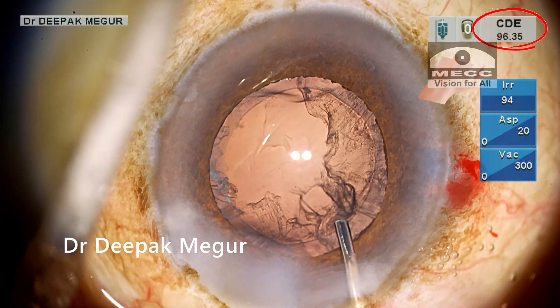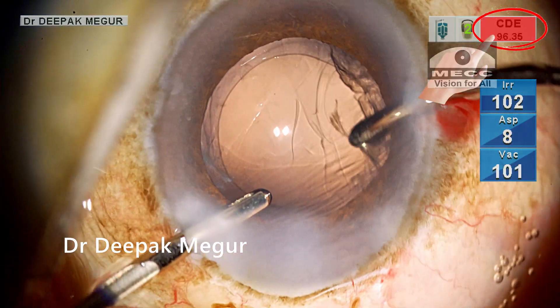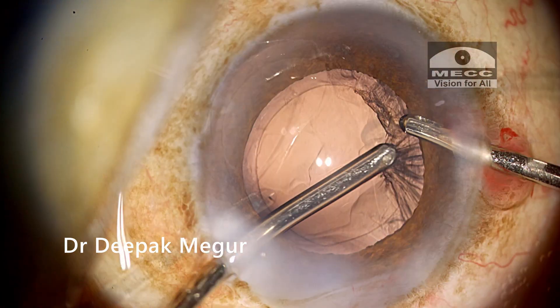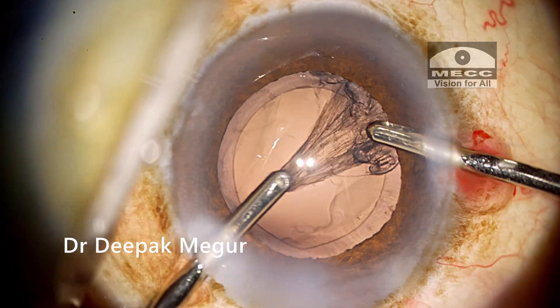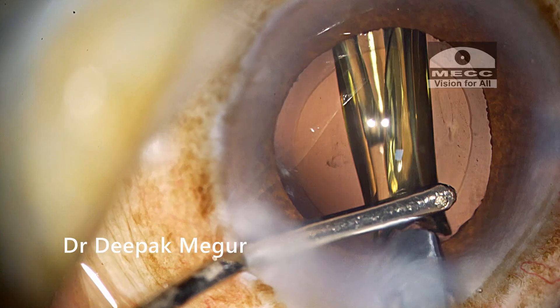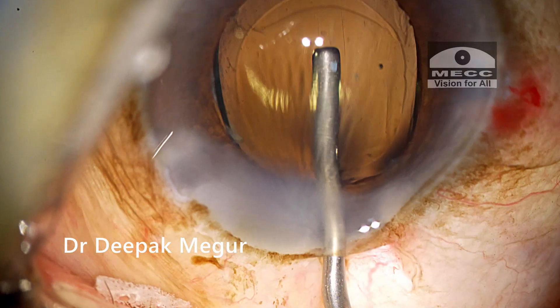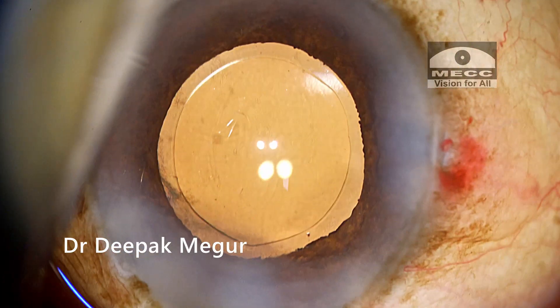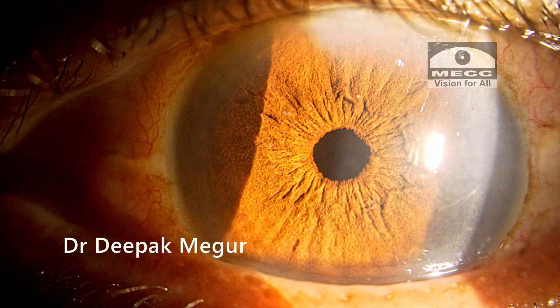The cumulative dissipated energy (CDE) is very high — almost 10 times more than my routine soft cataract cases. Let's see how much impact it has on the corneal endothelium in post-op pictures. The lens is implanted and the case is done — now is the time for the results.